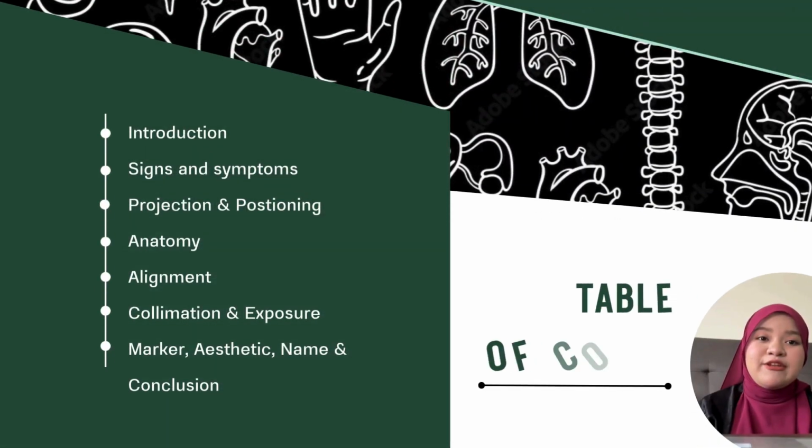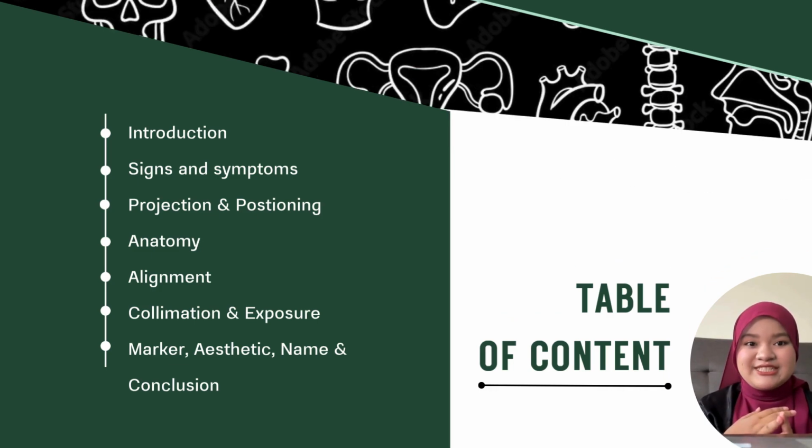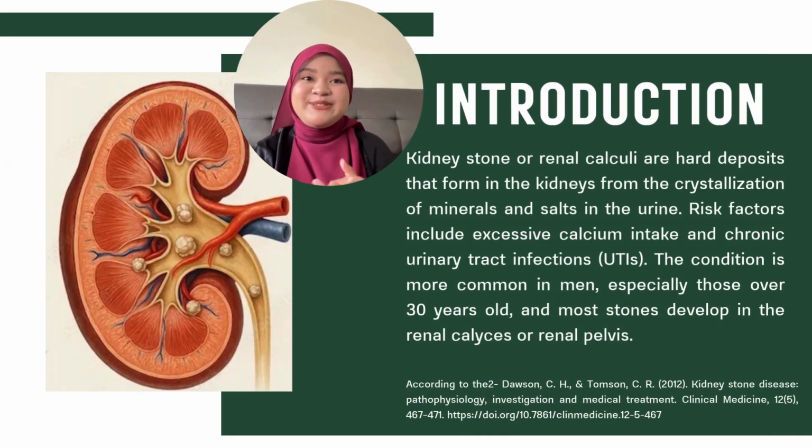So here we have the table of contents, which starts with introduction, sign and symptom, projection and position, anatomy, alignment, collimation and exposure, marker, aesthetic, name and conclusion. So we are continuing with the introduction.